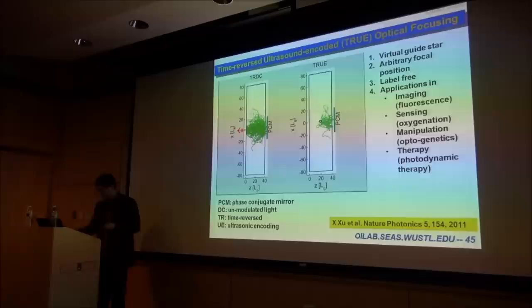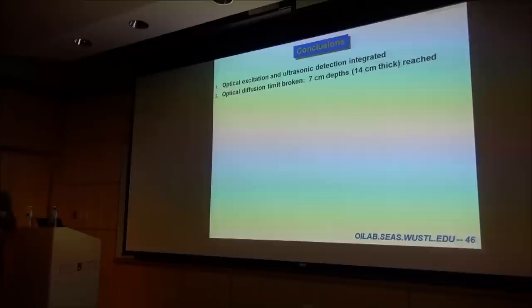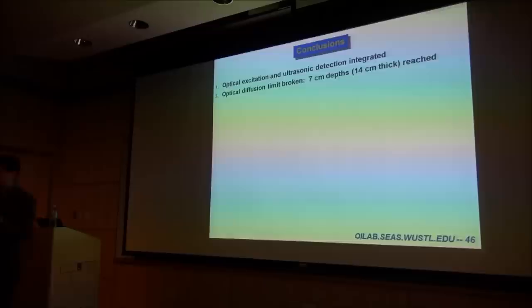Here's a quick summary, and we're running out of time. Photoacoustic tomography is based on light excitation and ultrasonic detection, but they're integrated in a single modality. The optical diffusion limit has been broken. We penetrated up to about 7 centimeters. If you penetrate from both sides, obviously you double. So you can image really sizable objects already.